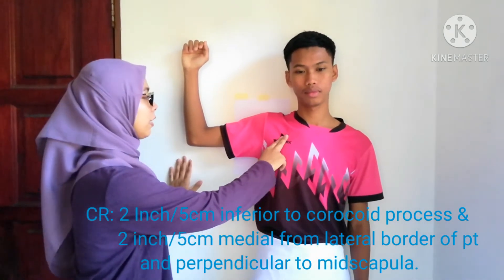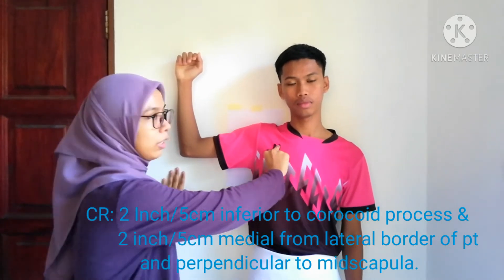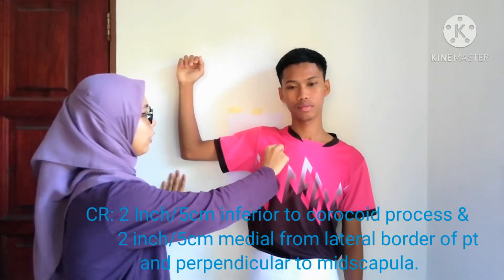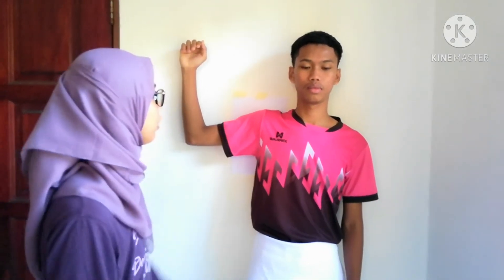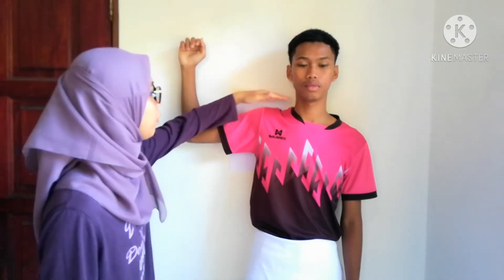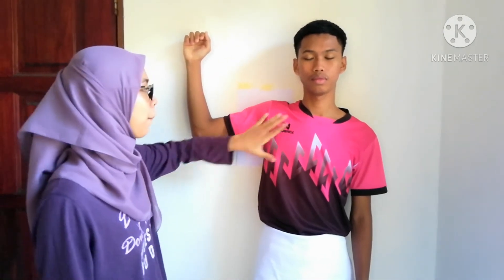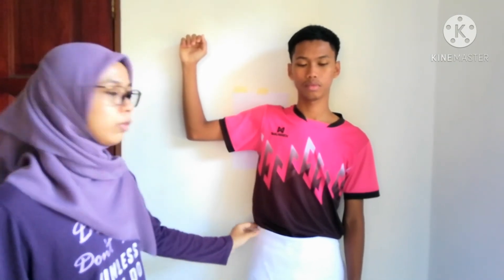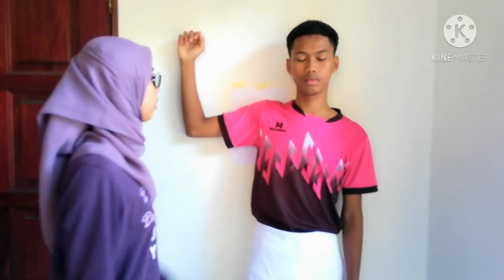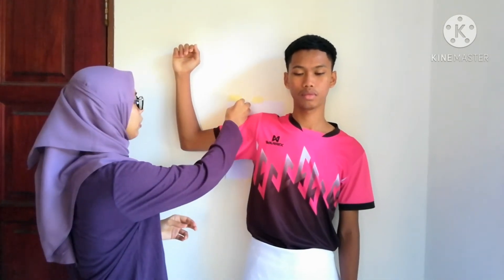CR is centered to the IR. Make sure it's in the mid-scapular area. For the collimation, collimate to the four sides of the area of the affected scapula. Make sure the patient has the gonad shield, and then place the marker on the right side.